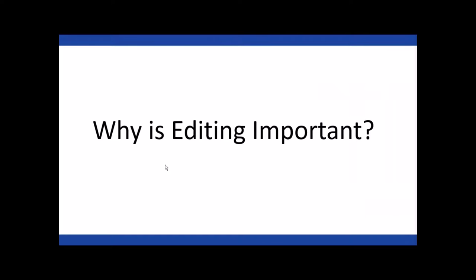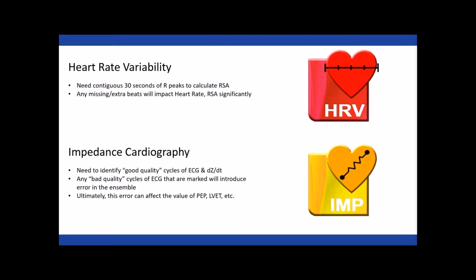So why is editing important? Sometimes we're looking at segments of 120 or 300 seconds of data. Does it really matter if the occasional R peak is not marked correctly? Absolutely. It's a good time to mention the difference between editing for heart rate variability versus impedance cardiography. For heart rate variability, we need a 30-second contiguous window of peaks to calculate RSA. If you miss or add any beats, it's going to increase or reduce the variability and affect your RSA measure.